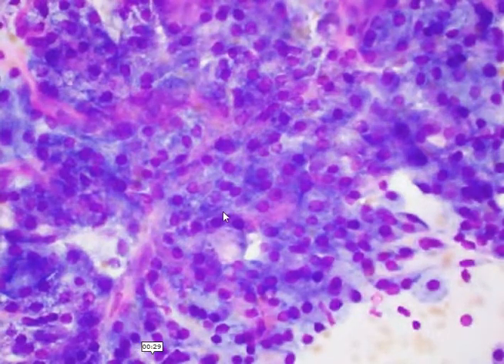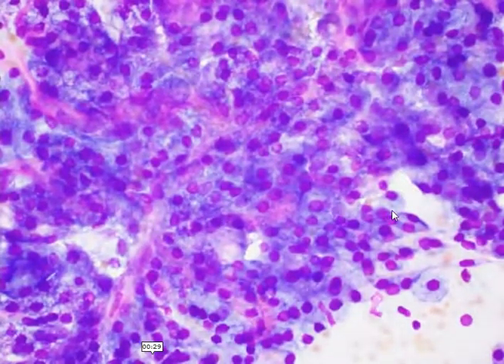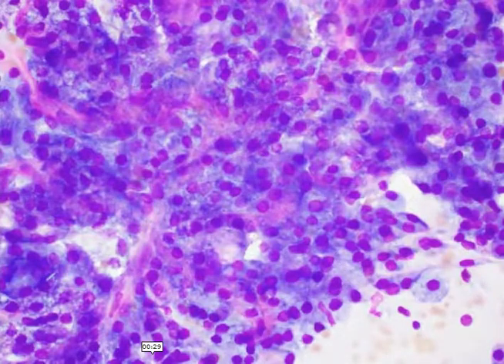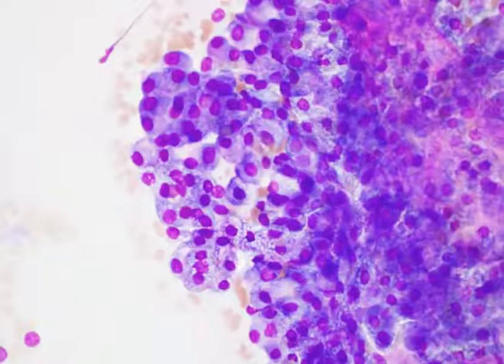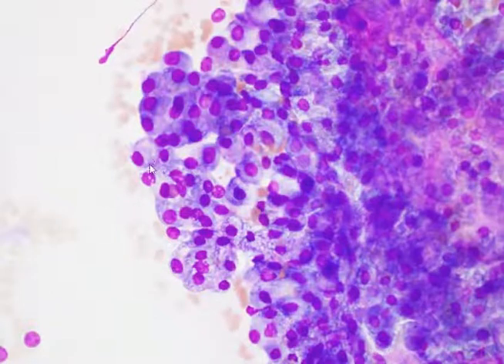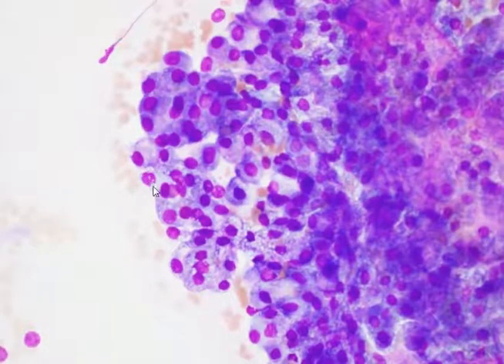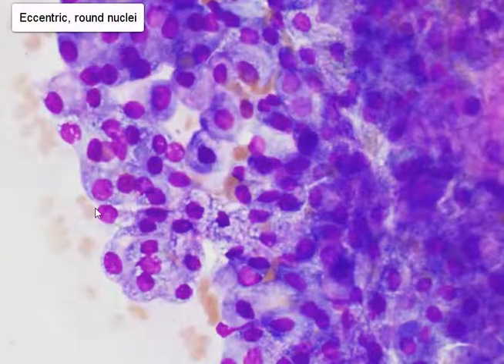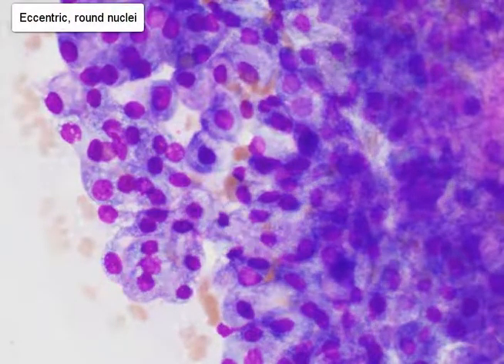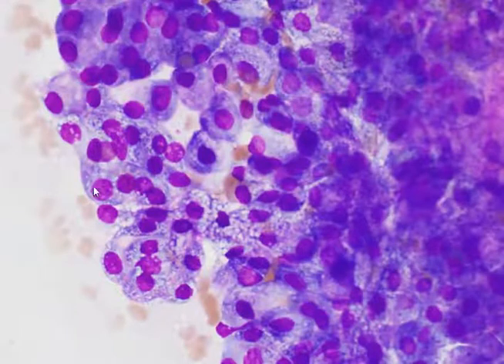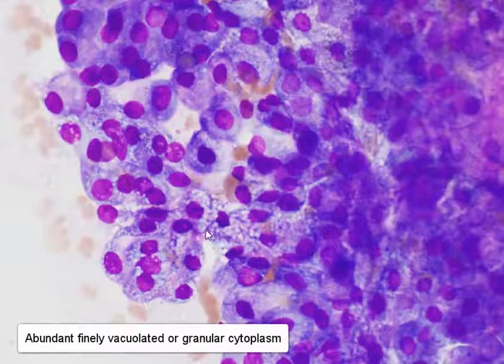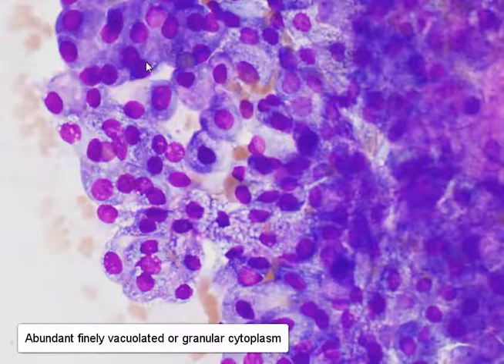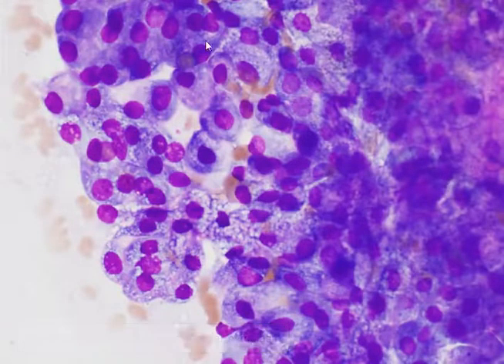We can appreciate that the cells have quite low NC ratios at this high-power view. Zooming in a little bit more, we can see how eccentric many of the nuclei are and the fact that they are quite round with smooth nuclear membranes, a hint of nucleoli in some of the cells. We can also appreciate that the cytoplasm is abundant, very finely bubbly, and in some areas more granular.